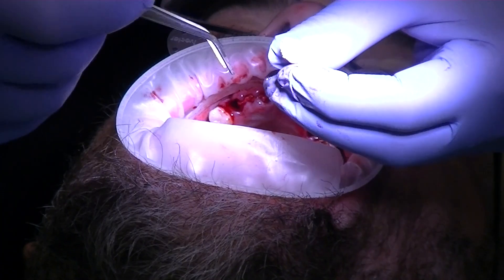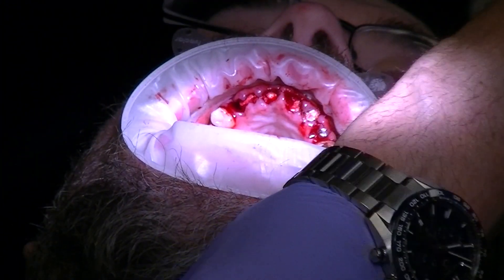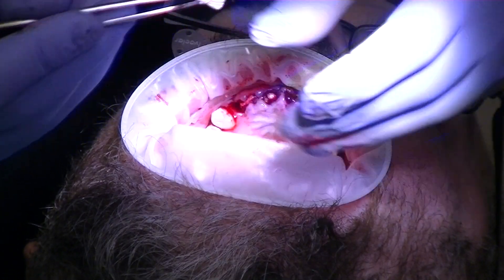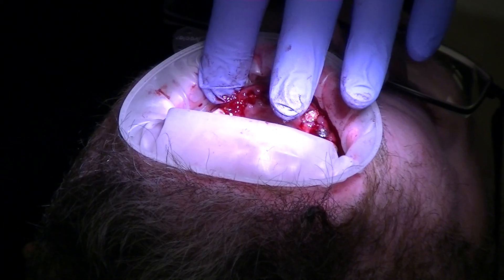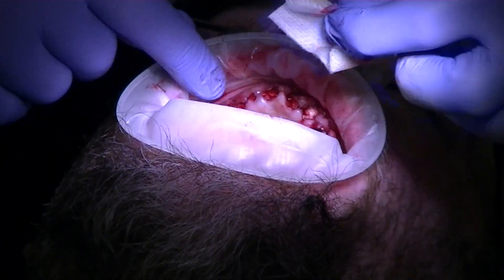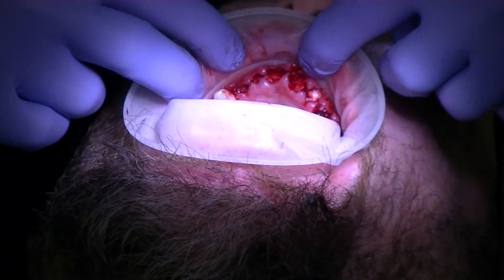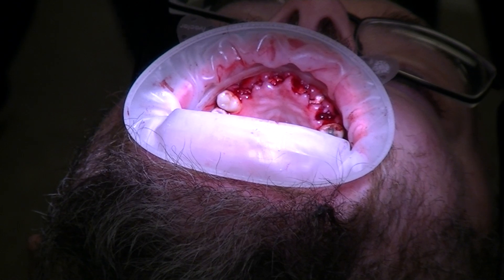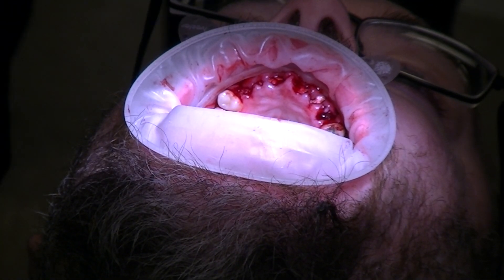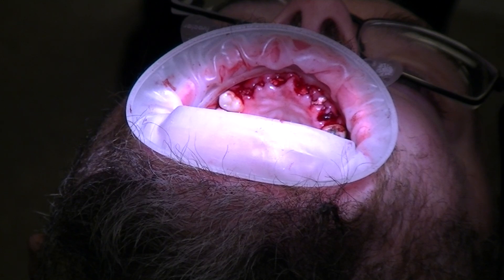Everybody saw — you don't have to use brute force; it's all in the technique. His bone and gums: the gums were bleeding but these weren't periodontally involved and they were good-sized roots. You can already see how nice that's looking. I don't think you need to watch me stitch — let's get started since we got a little bit of a later start. Kevin was a great patient; one or two of you can come in and take over after I suture.